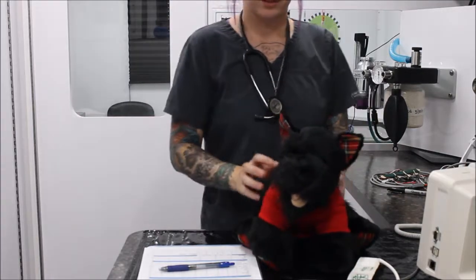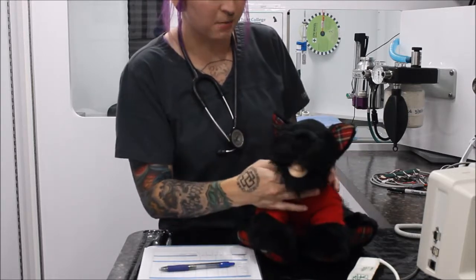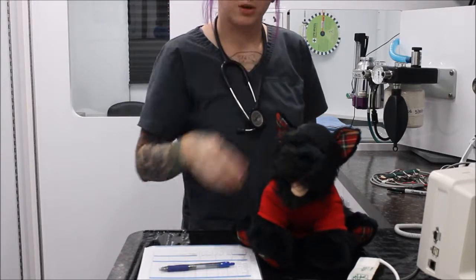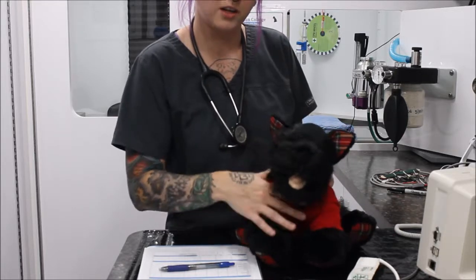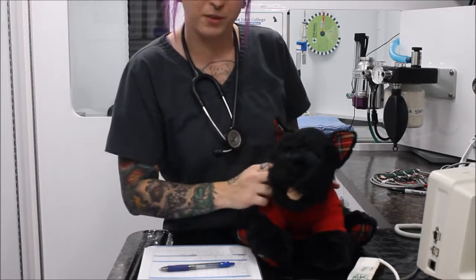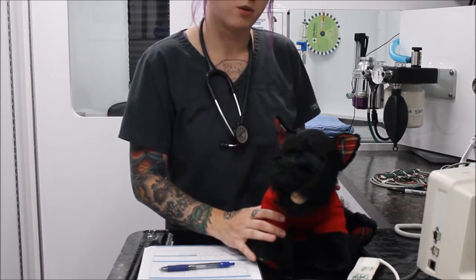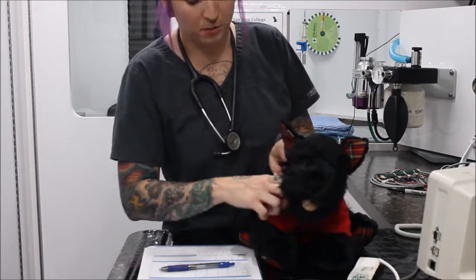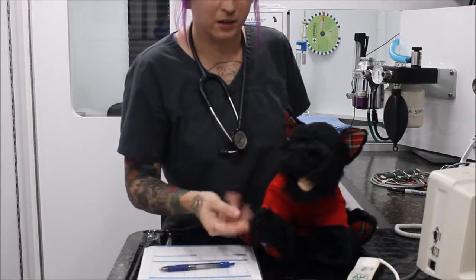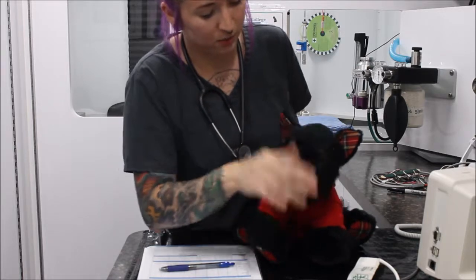Then another one we'll check for is laryngeal, or the swallow reflex. Usually you can initiate that by gently rubbing the patient's throat and seeing if they have any kind of swallow reflex. When it is gone, it is okay to go ahead and start to intubate. But we also like to monitor that when they're recovering. We won't extubate them until they give us about 2 or 3 good hard swallows. We just want to make sure that reflex is present so they don't end up aspirating, they don't pull the tube out too soon, and they can't control the laryngeal part of their body.